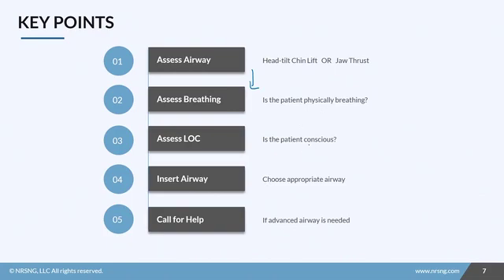Then we're going to assess their level of consciousness. Are they conscious? Are they unconscious? If they're conscious, your only option is a nasopharyngeal airway unless they are struggling to breathe and need to be intubated. If they're unconscious, the best option is the oral airway.